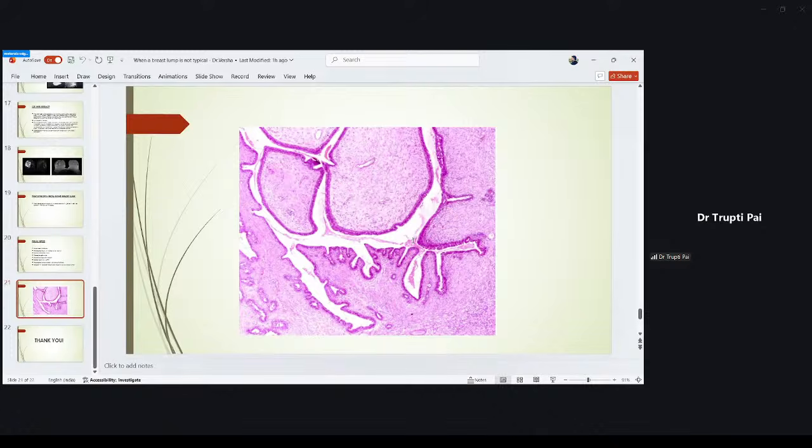If you see a lot of epithelial component and very little stroma, then it is too much of a struggle for us. Sometimes in this kind of heterogeneous lesion, you get a lot of areas resembling fibroadenoma. Just having a leaf-like architecture doesn't mean it is a phyllodes tumor. We have to focus on the stromal elements. Stromal overgrowth: what do we mean by it? Very little epithelium, and under the microscope you just see stroma, even if it is bland. Or you see heterologous elements like cartilaginous areas, very high grade round cells in the stroma, or tumor necrosis. So these are certain findings.